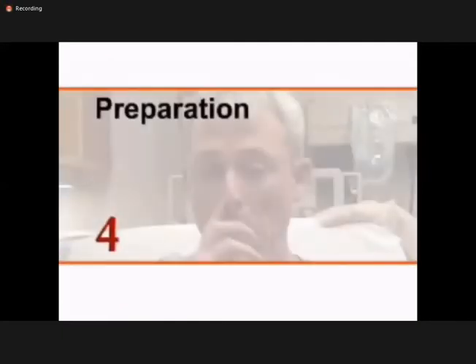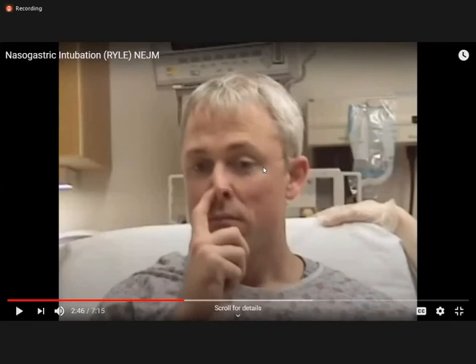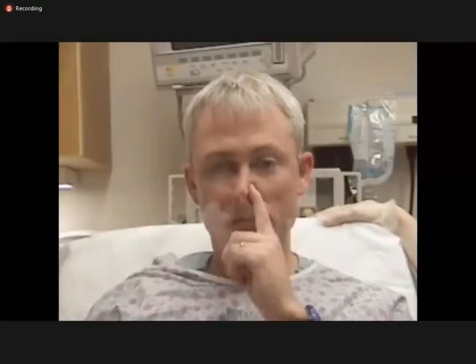Have the patient breathe in through each nostril to assess which side is more patent. Now he is checking for nasal patency, whether there is any nasal blockage. If one nostril is blocked, we avoid it and place the NG tube in the other nostril.